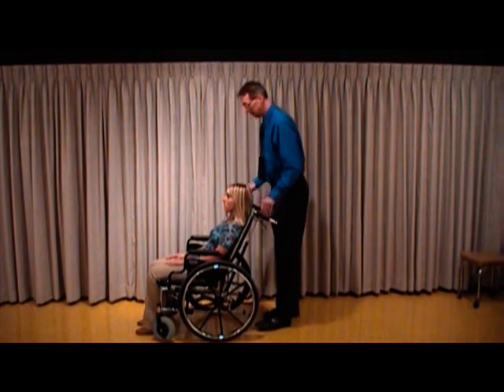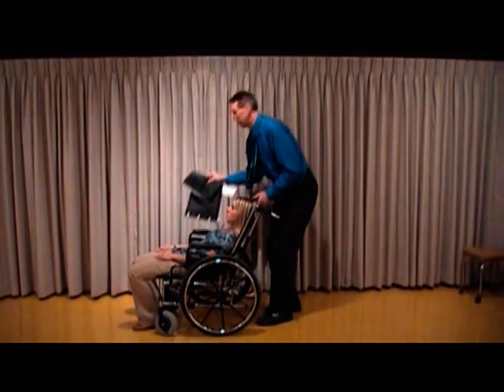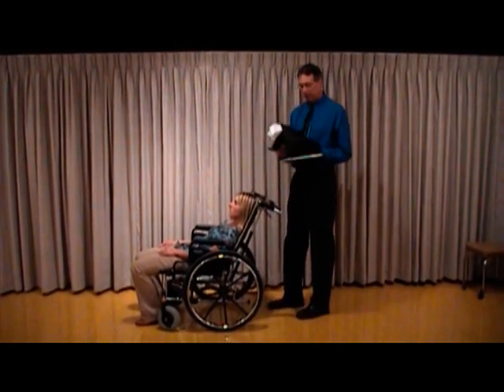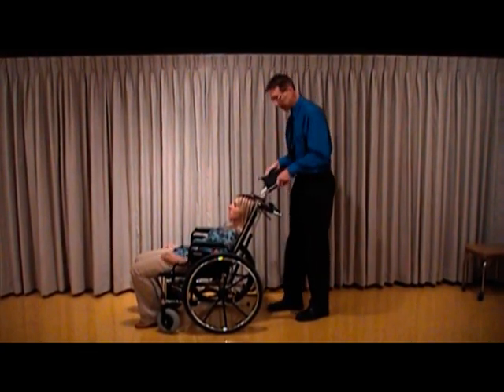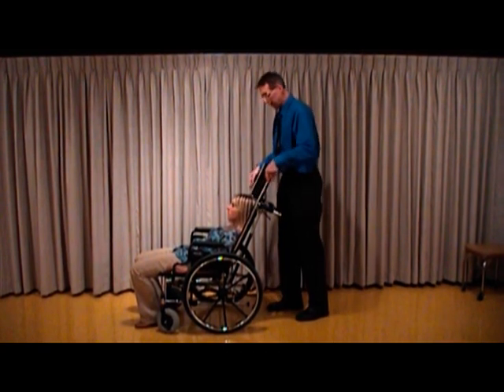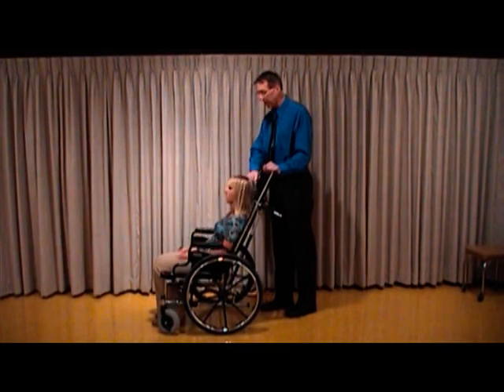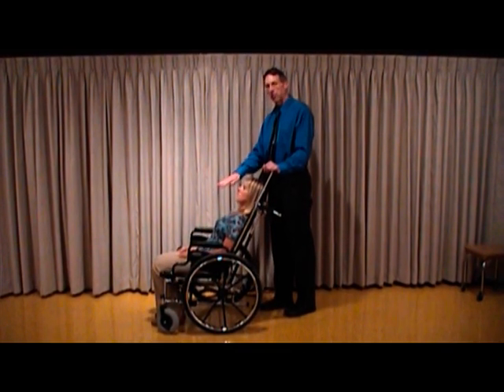which is fine, except now you've got to maybe make sure you have a headrest, and also they're going to have the tendency to want to slide forward. So again, this is a great chair because it has a lot of adjustments. So if Lindsay wants to come up, she can now support her head. Still doesn't solve the problem of her sliding forward, but we have something for that.